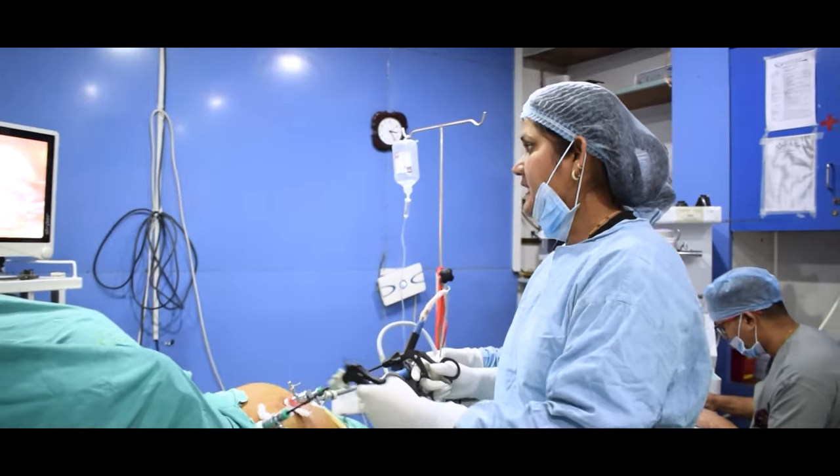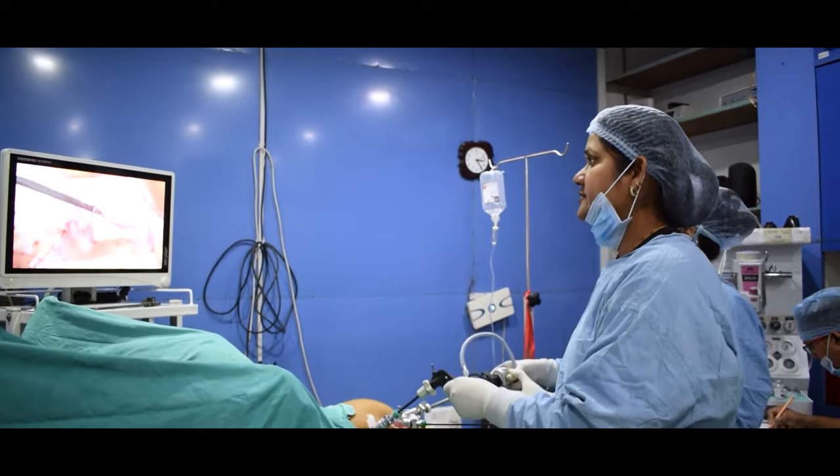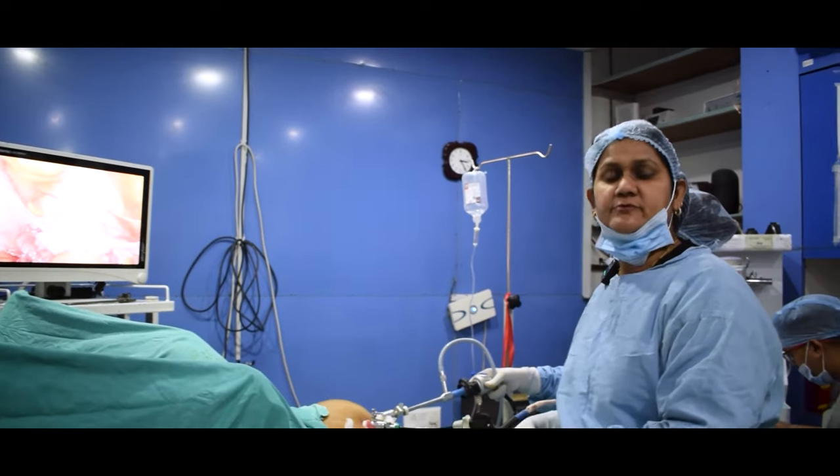Hello friends, today we are going to do a surgery for our patient, which is called a hysterectomy operation — a uterus removal operation.